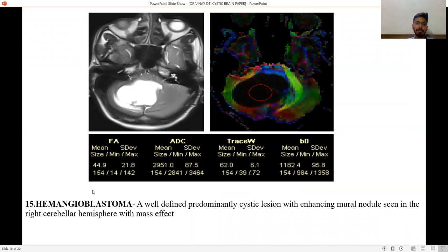MRS shows a large lactate peak. Hemangioblastoma — a well-defined predominantly cystic lesion with an enhancing mural nodule seen in the right cerebellar hemisphere with mass effect.